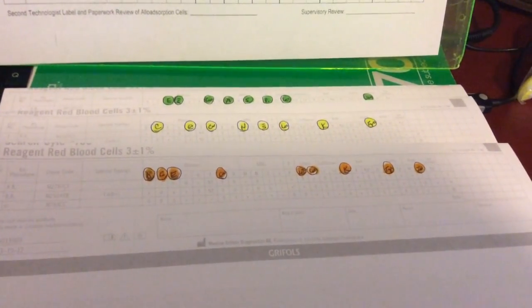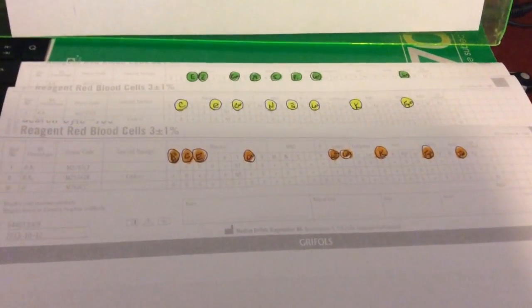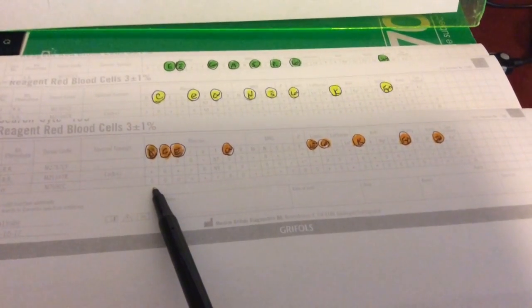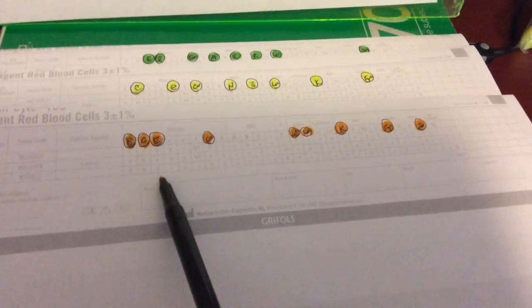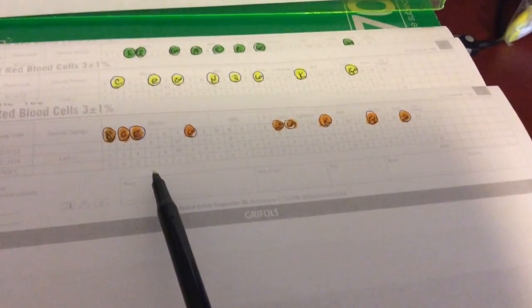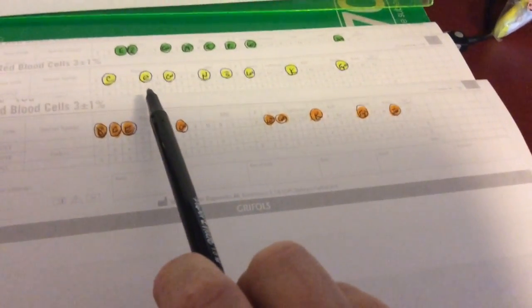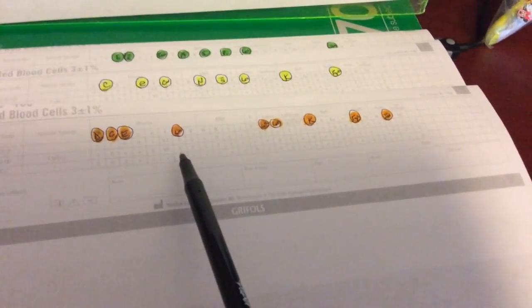If we looked at our panels that I just set up, the R1, the R2, and the little r, if you go vertically below each one, you can see that the little r rules out D. The big C will be in the little r, and the R2. The big E will be in the little r, and the R1. Little c is only ruled out in which serum? Well, only R1. Little e is ruled out in only one serum, which is in the R2. CW is in all three.